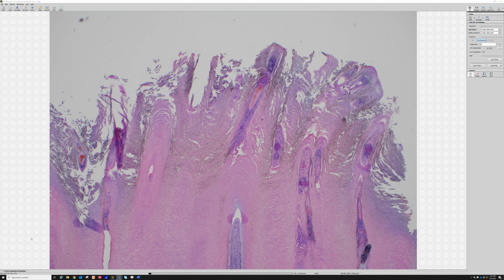Almost certainly. Now, if it's on the forearm of an 80-year-old sun-damaged guy, then I have to be a little more cautious, because there are times that you can have very wart-like features on the top surface of an invasive squamous cell carcinoma. So in cases like this, I'll say, well, this is suggestive of a superficially sampled verruca, but there's very little actual viable epidermis here, living cells that I can actually look at. So it may not be representative.